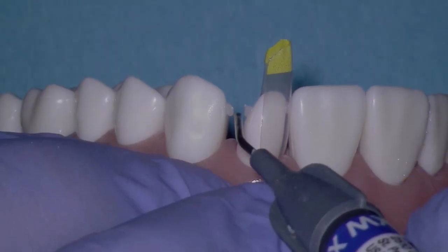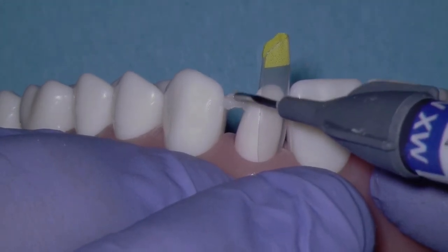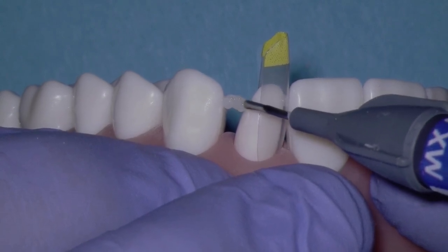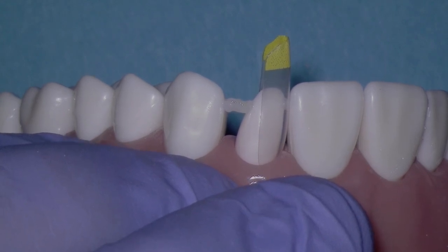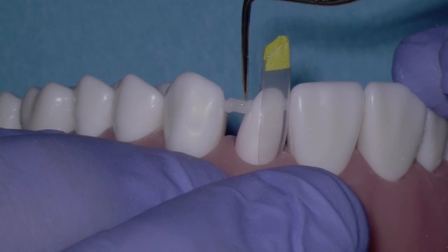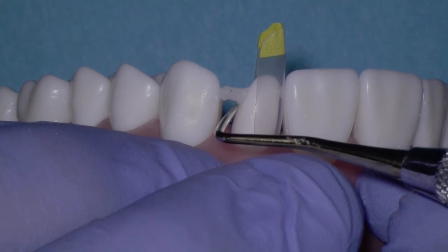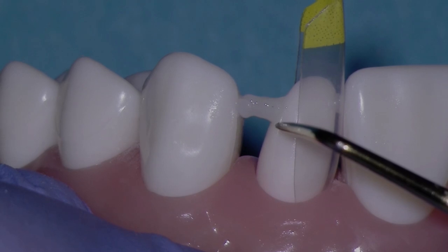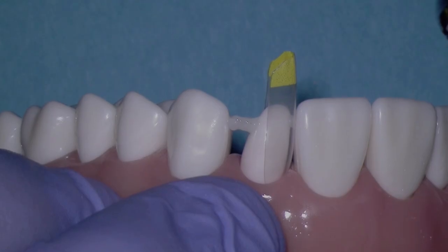Now let's finish our bridge, making sure that the base on the peg lateral side is reasonably wide. We want to make sure that the direct contact strut is smooth and that we have a good purchase, or large area, on the adhesive tooth, or the peg lateral tooth. So we'll make the base of the peg lateral a little bit wider than the base on the Vaseline tooth, or the canine. Let's go ahead and light cure.